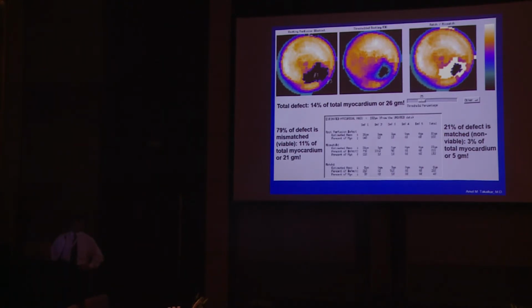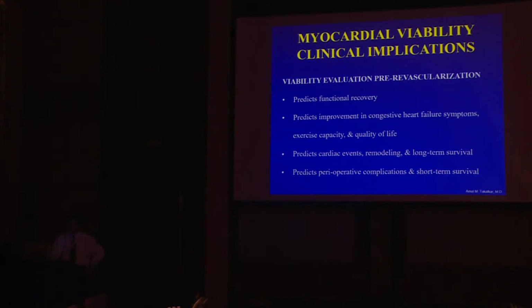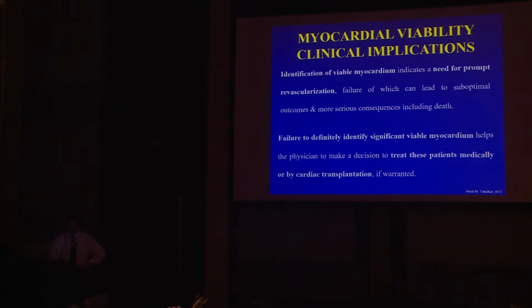So there are ways to quantify this, and these quantifications help the surgeons a lot to determine how well a patient will do and how much symptomatic benefit is expected after a successful revascularization procedure based on these quantitative studies. Some more quantitative studies. In the interest of time, I was given only 10 minutes, so I'm going to cut short on that. These studies have been validated. They show that they predict functional recovery, periprocedural risk and mortality, and those kinds of things.